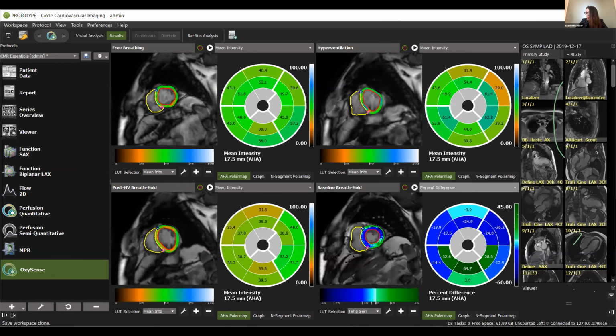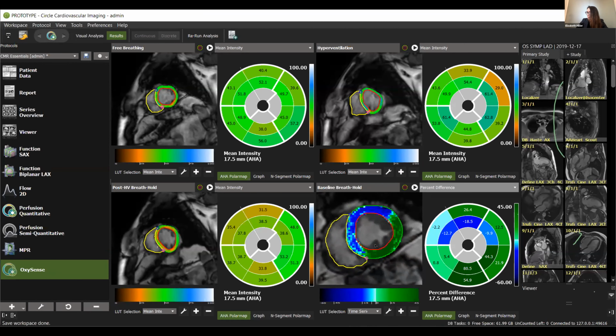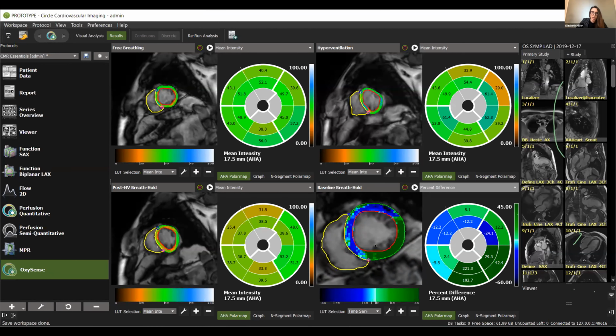And these are both of our slices here. So this is the more basal slice. You can see it going into diastole, coming back into end systole, where we take most of our measurements. Again, moving down to a more mid slice. You can maybe even zoom in a little bit here, so we can really appreciate the full extent of what we're seeing here. So this is quite striking. This made me really happy to see.